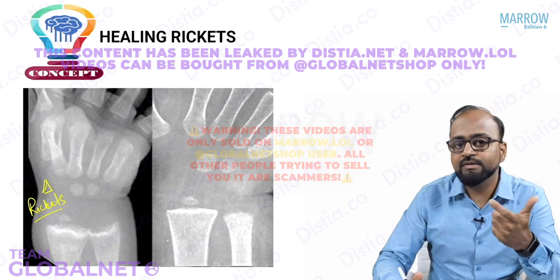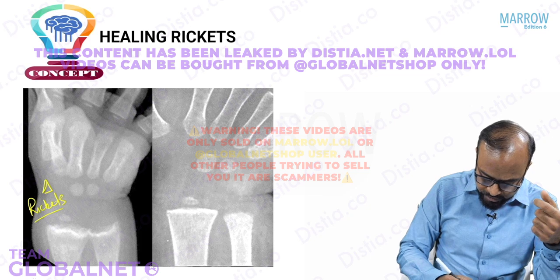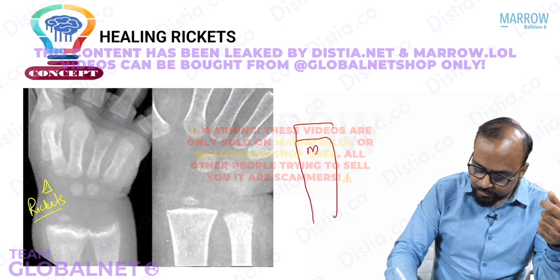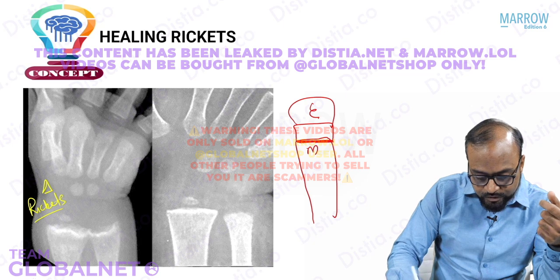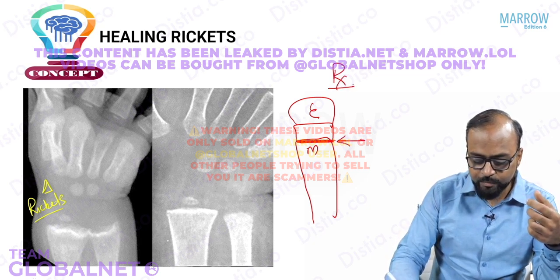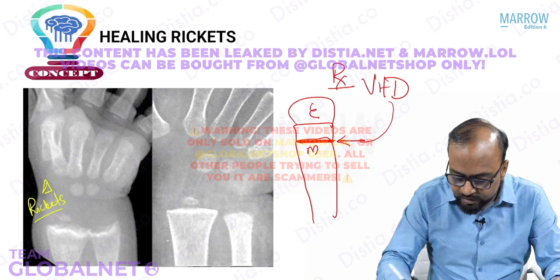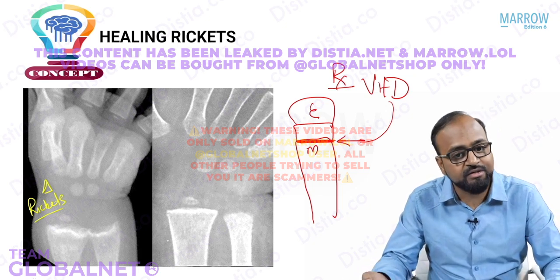Right now, how do we monitor whether the child is responding to treatment or not? Do you remember I told you the role of vitamin D? I told you that if this is the metaphyseal margin, the role of vitamin D is going to be the calcification of this metaphyseal margin here. So as soon as you give a therapeutic dose, vitamin D becomes available. What will happen? The calcification of this metaphyseal margin will start, and that is a sign of healing rickets.